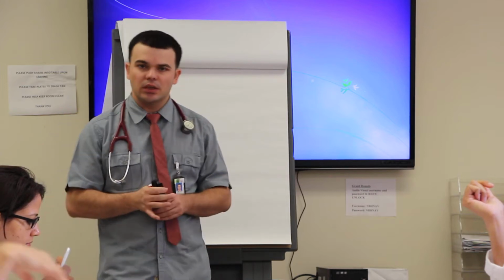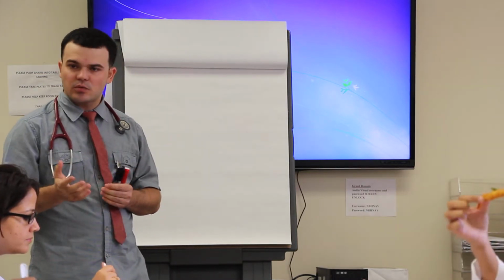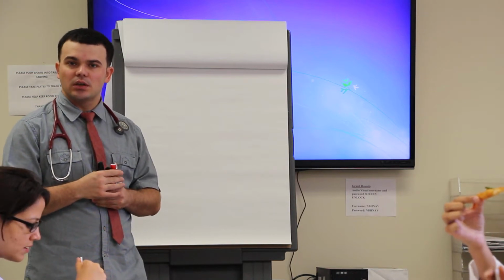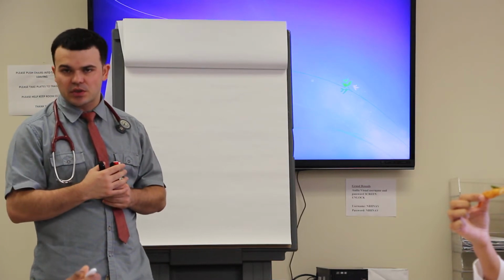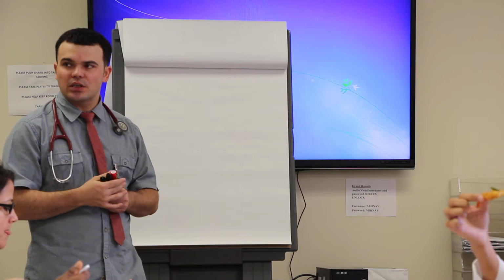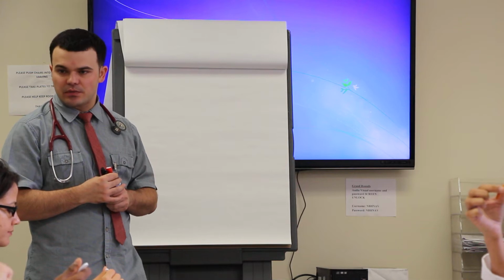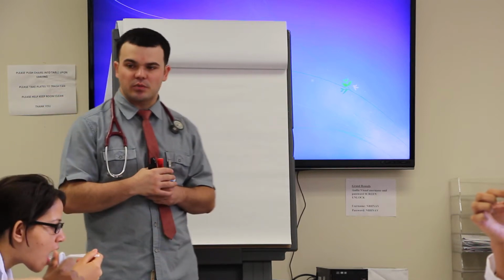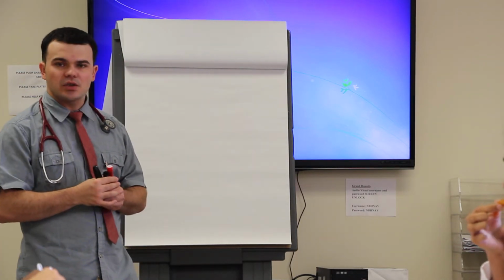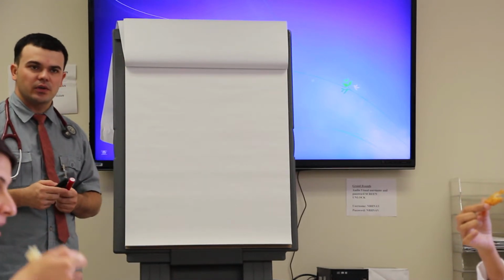And before you jump into reading and having a systematic approach to EKG, you should ask yourself, as with anything that you order, why did I ask for an EKG? If somebody comes with chest pain, it makes sense that you're going to be hunting for ST depression, ST elevation, T wave inversions, all sorts of changes that are consistent with ischemia. If somebody comes with syncope, you may want to chase arrhythmias, if you're thinking of some paroxysmal event that triggered the syncope, and you want to make sure that this is not paroxysmal AFib or aflutter or whatever. So ask yourself, why did I ask for the EKG? Then we're just going to run down the waves and figure out what's going on.